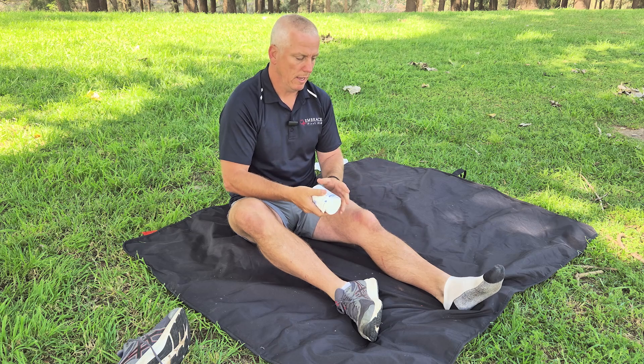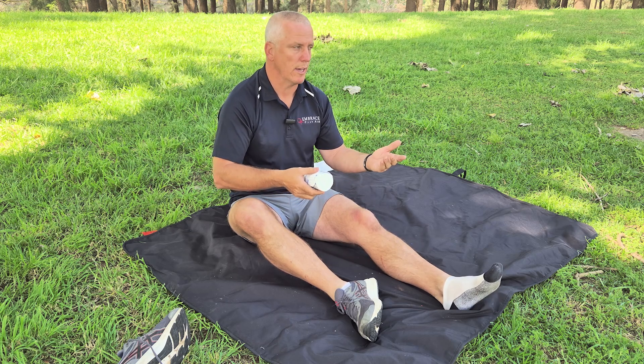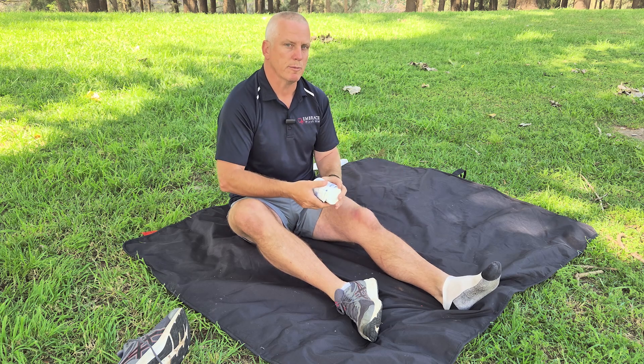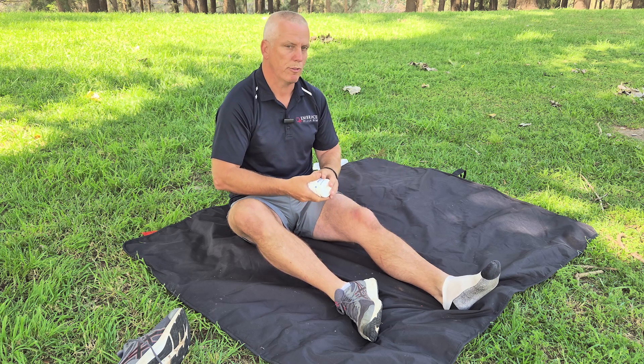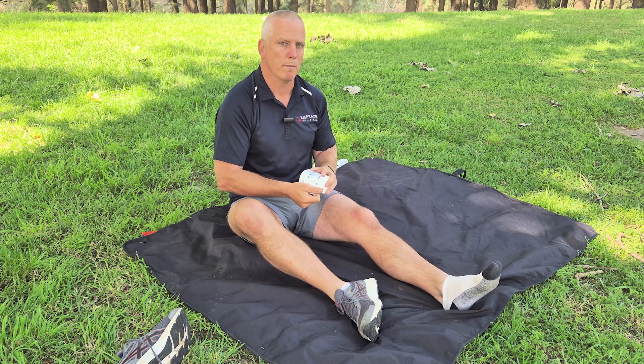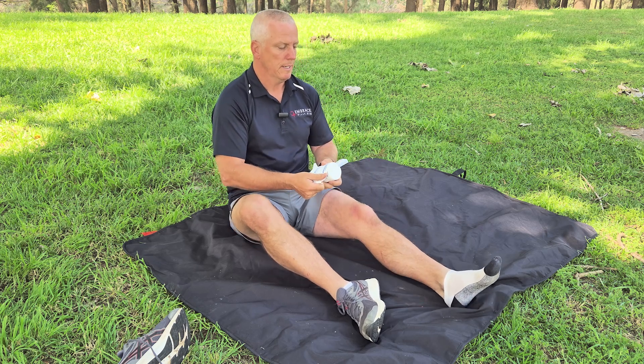You can apply an Evo bandage by yourself because you're not really with someone all the time. It's quite a simple process, very much similar to the way you put it on somebody else. You want to minimise movement as much as you can because the snake venom will travel through the lymphatic system, and that's increased by movement, so you want to restrict movement as much as possible.